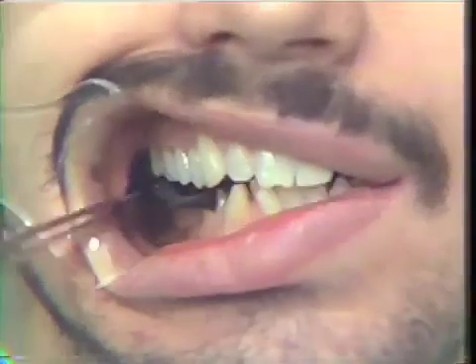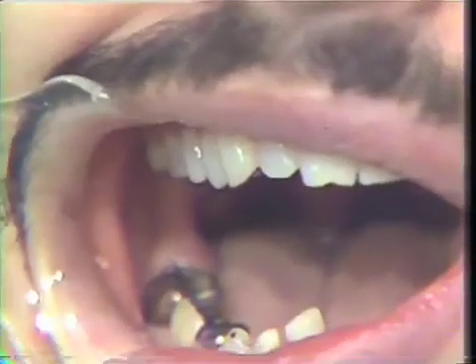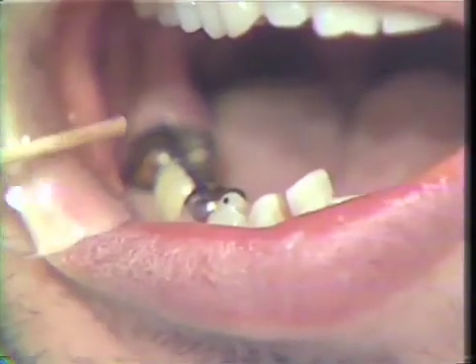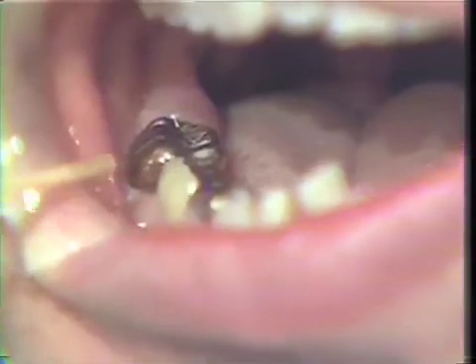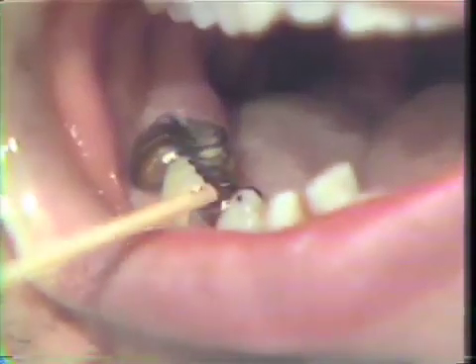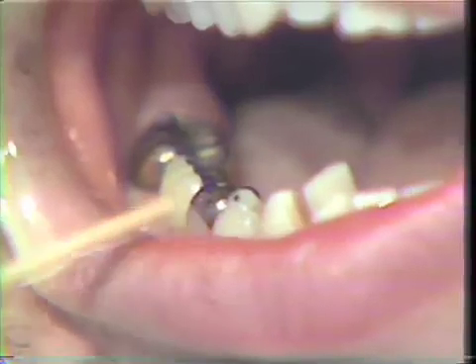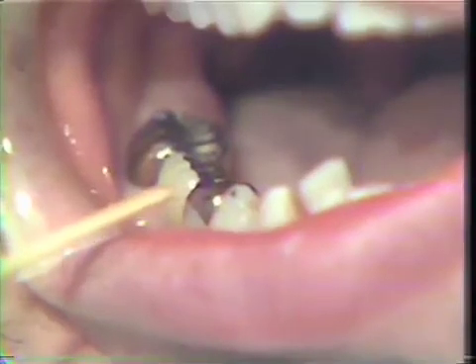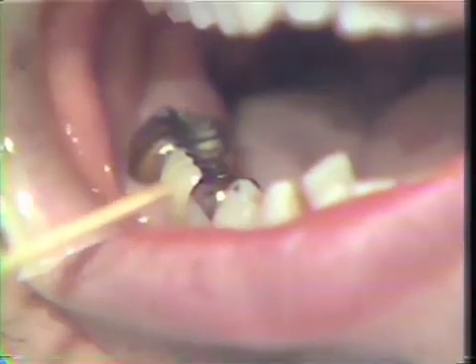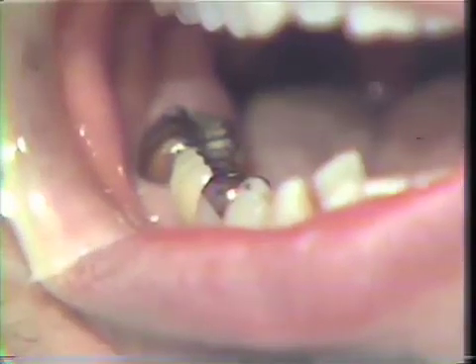Back together, please. And slide towards me, please. Fine. Open, please. Good. We do have a small area of working contact on the pontic, which we would like to relieve. We do have some working contact on the buccal of this bicuspid, which we had in the original dentition, and we have moved our guidance back into the mesiobuccal of the second bicuspid to take some of the lateral force off the first bicuspid.